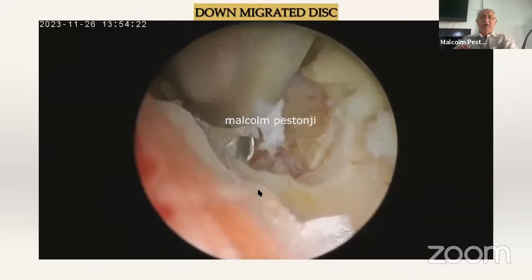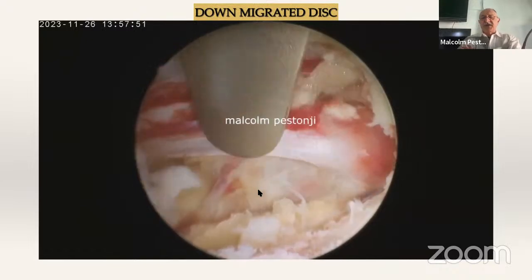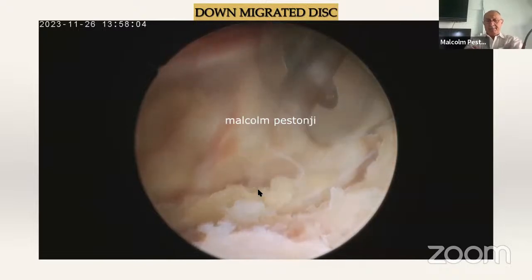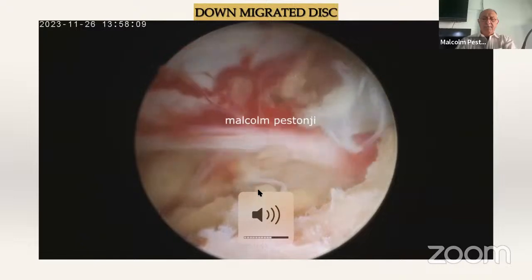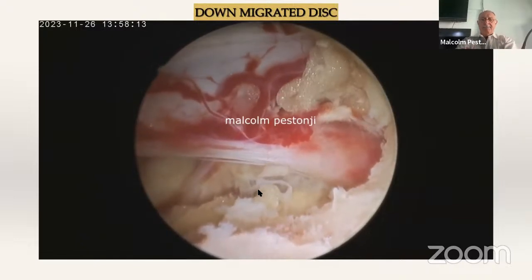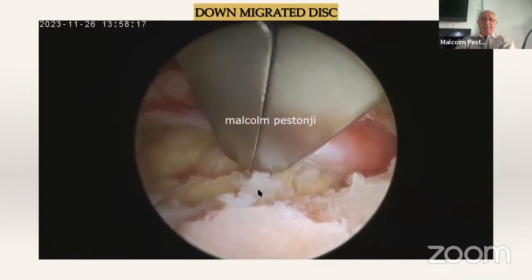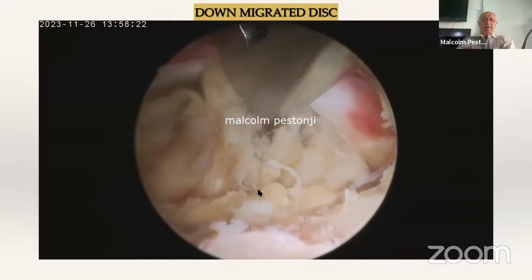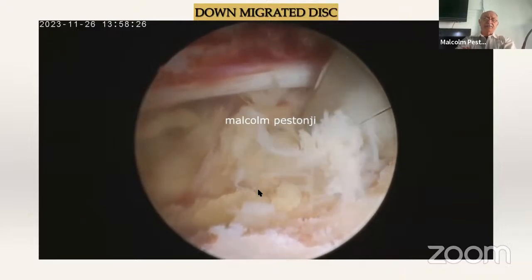As you can see, I'm working in the superior edge of the inferior lamina and the SAP junction. I prefer to remove 2-3 millimeters of bone to expose the traversing root as it enters the canal. I then place a small dissector to enter the subligamentous zone, and then using my disc punch as a retractor, turn, rotate, and grab a fragment.